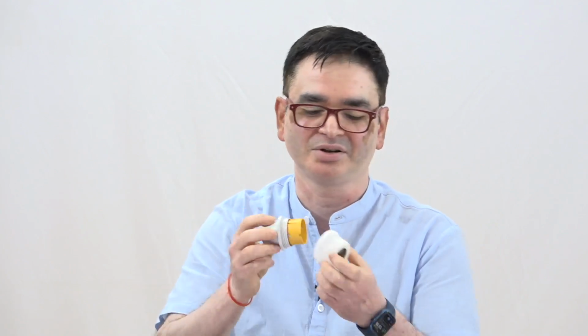That's how it looks, right? Yeah, that's how a FreeStyle Libre 3 sensor looks. Simple thing, you open it up. Ideally, I would advise you not to look into it, because if you look into it, what do you see? Can you see it on the screen? No, you can't. You can see there's a hollow needle in there. You would think, oh, this hollow needle, I'm going to get a hollow, you know. You don't want to, so you just open it up. This is where the hollow needle sits.